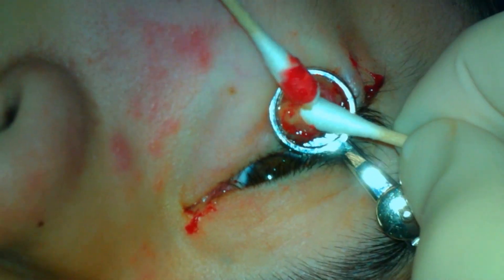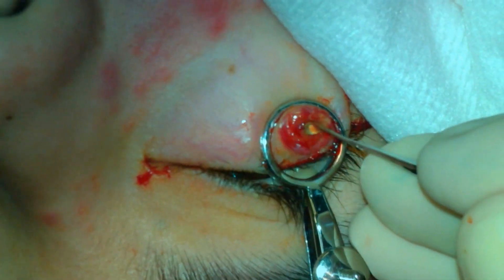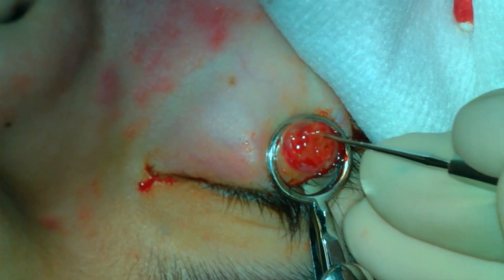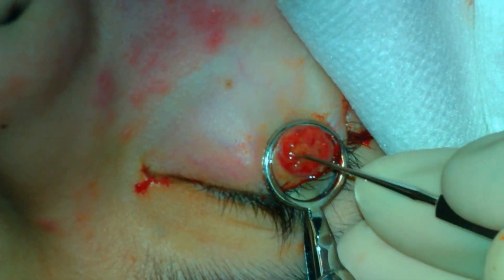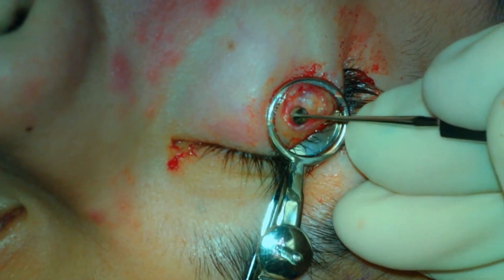This is performed to the anterior surface of the tarsus. The chalazion clamp will then be removed. No sutures are placed.